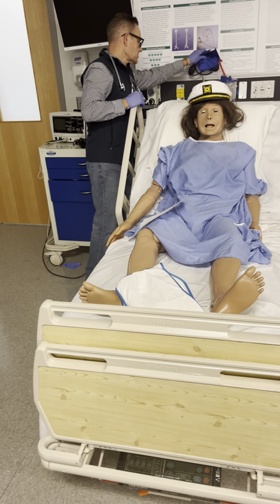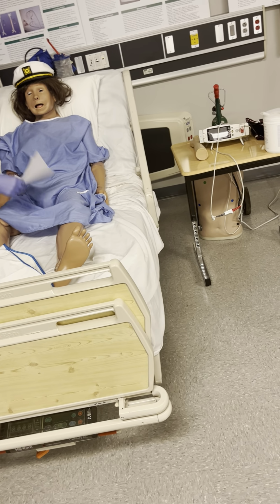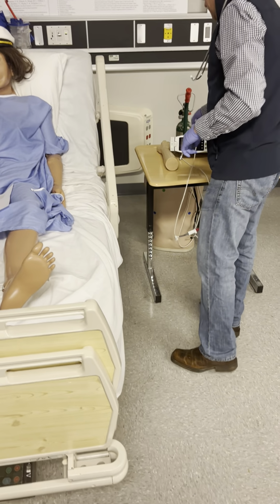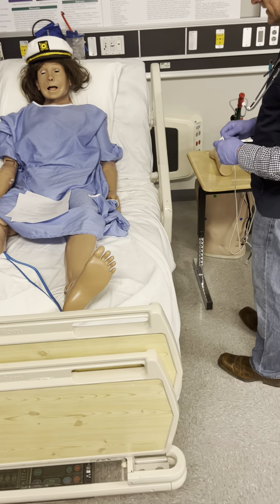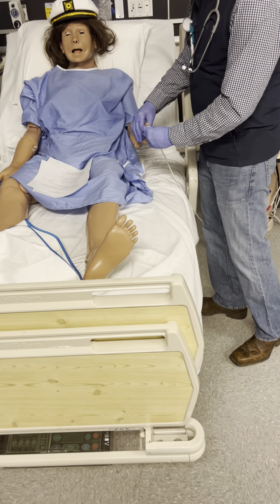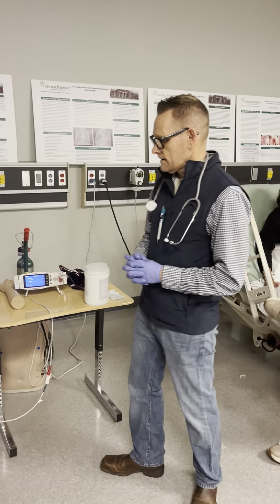And then we're gonna measure her SpO2, which is on the other side. So we'll come over here, make sure that the finger probe is clean with alcohol, turn this on, and we've all done this before. Place this on her finger, and of course, since she is plastic, we're not gonna get anything. We're gonna monitor her waveform just to make sure we have a good rate.